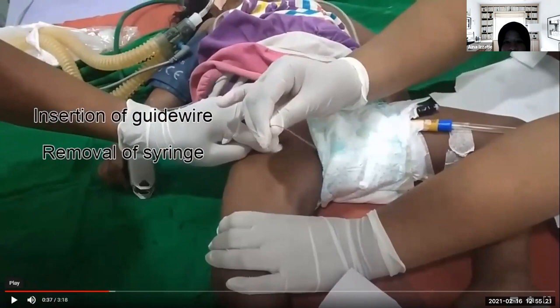Okay, for insertion of the guide wire, the guide wire should advance smoothly with little resistance, and we should never force the wire to be inserted. Usually, if we require force, the wire is in the wrong spot, and if we continue the attempt, it will only make the process harder, and it can result in a laceration of the vessel.